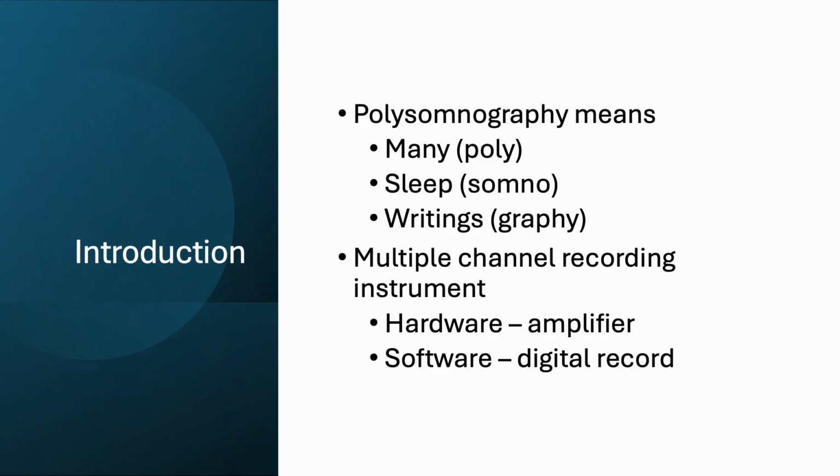A polysomnogram is produced by a multi-channel recording instrument comprised of a hardware device, often called an amplifier, that interfaces with software to produce a digital record of the biophysical changes to the status of sleep during the course of a sleep session.